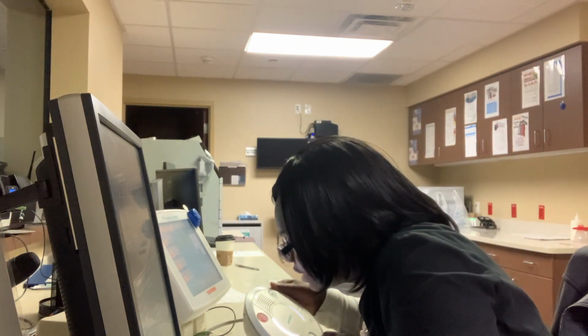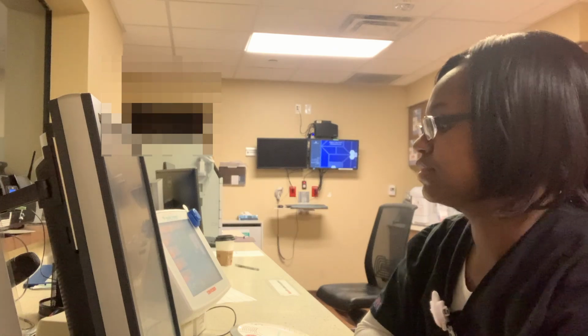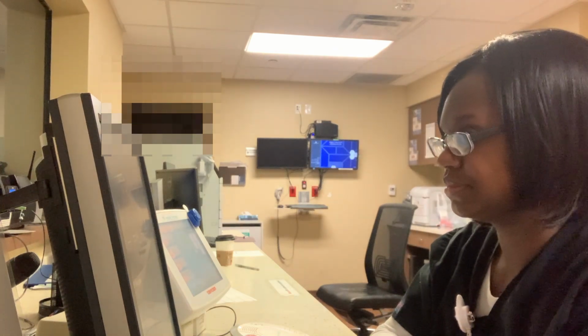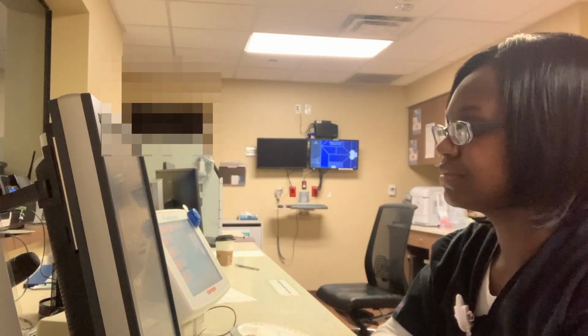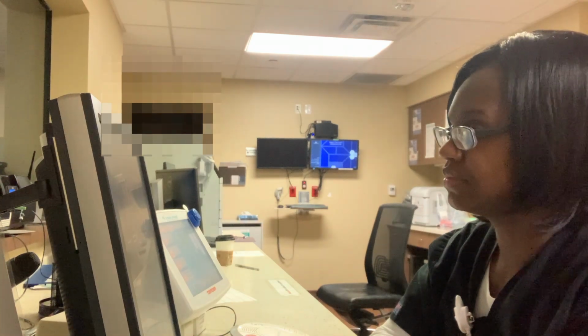All right, you're doing great. Last scan. Take in a breath and hold it.